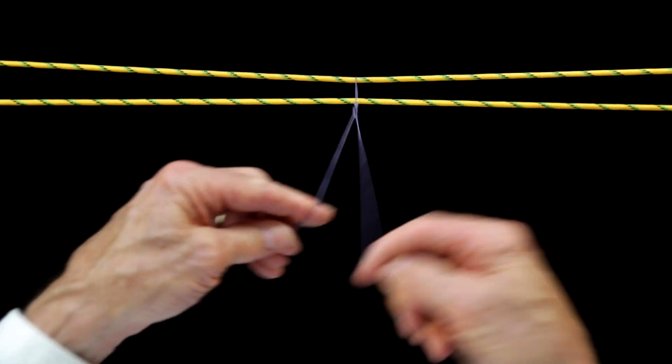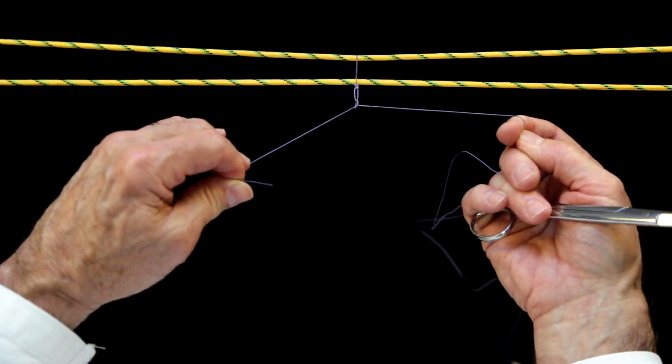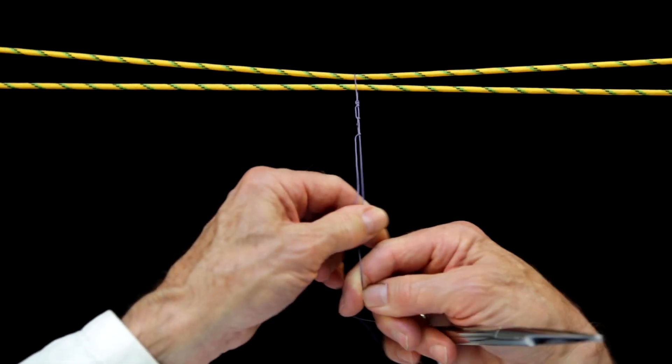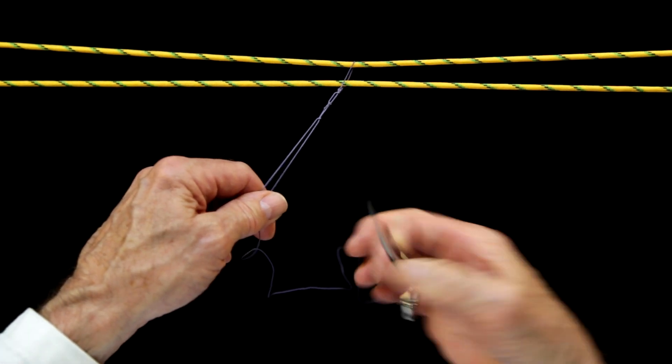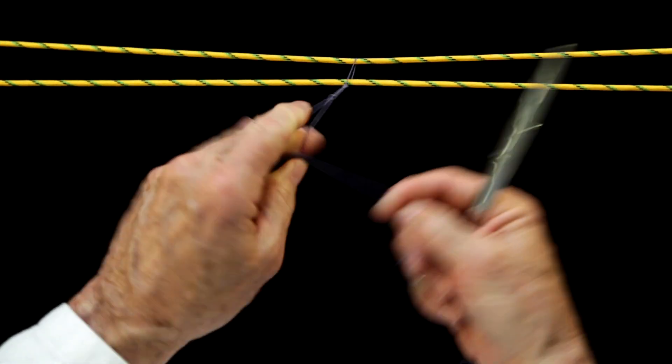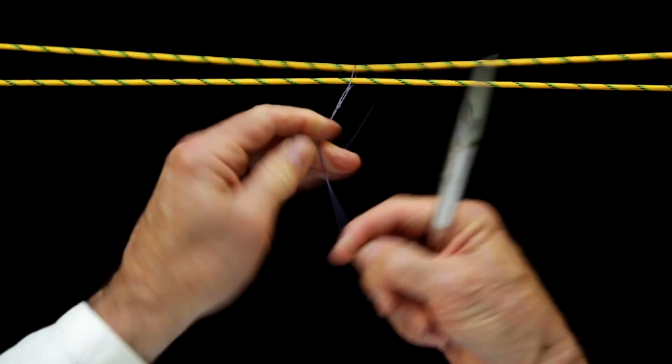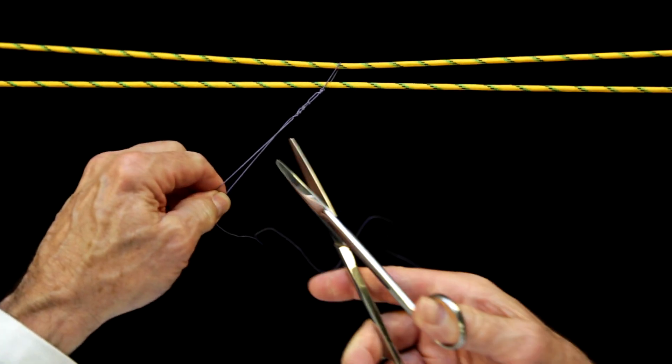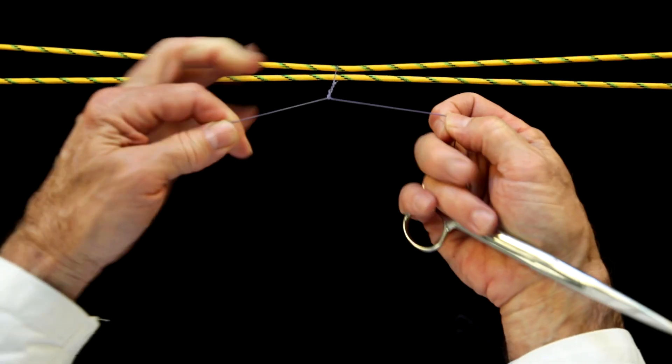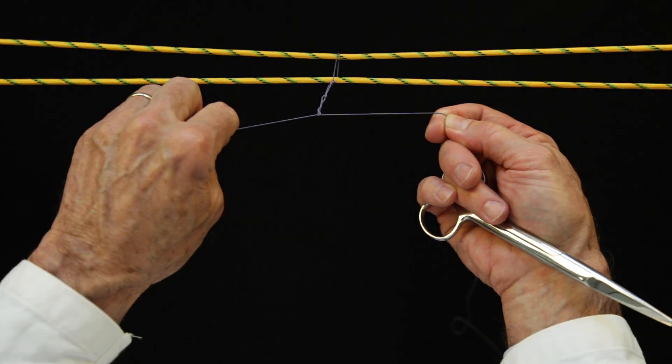I choose to pull with my right hand for two reasons. First, perfect tightness is what it's all about so I control tension with my dominant hand. Second, I can save a few little steps by palming my instruments, especially scissors or a needle holder. Got it? You're off to the races.